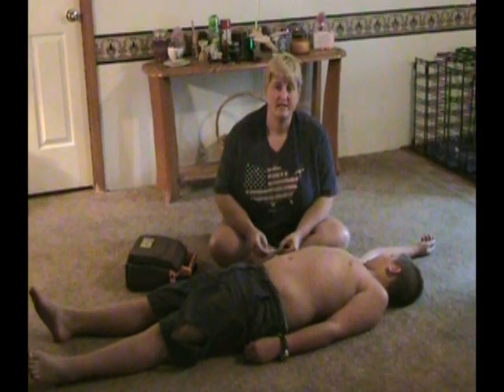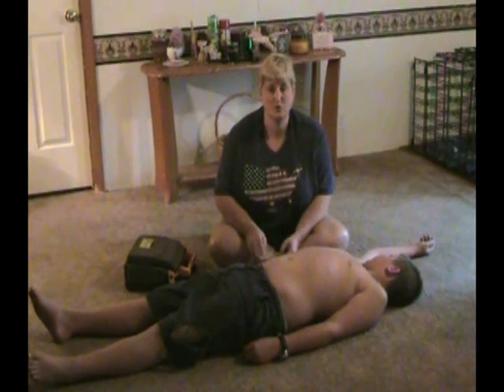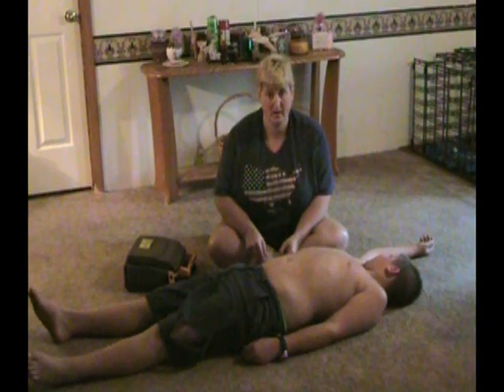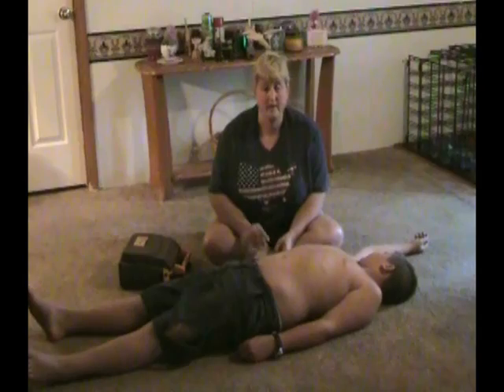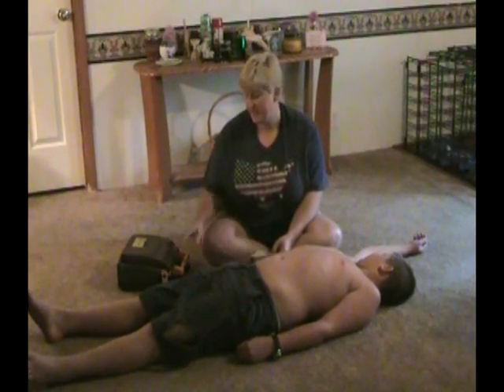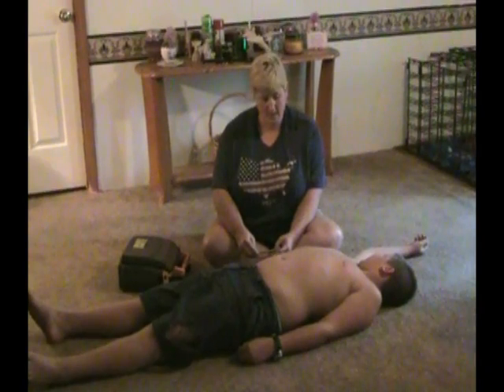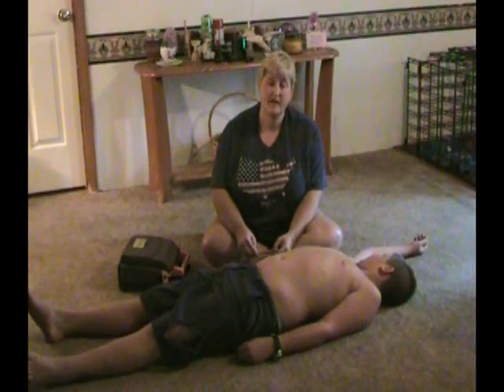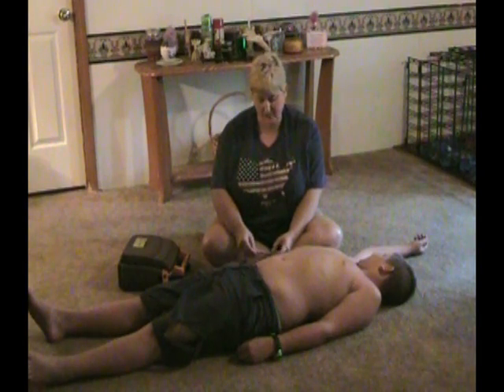If you witness a cardiac arrest or find a victim that is unresponsive, there are 3 things that need to be done very quickly. Number 1, call 911, get some help on the way. Number 2, retrieve the AED. And number 3, check for breathing and pulse. To assess for the need for an AED, we'll check for breathing and circulation.